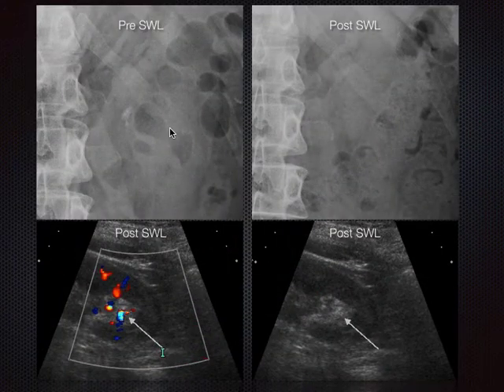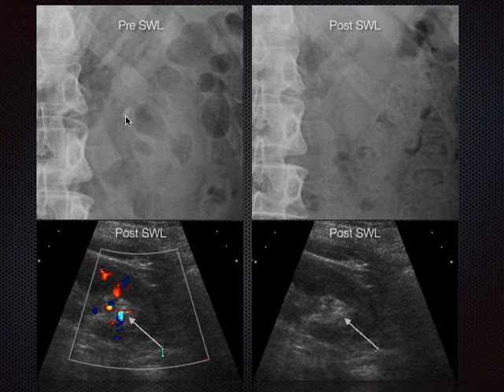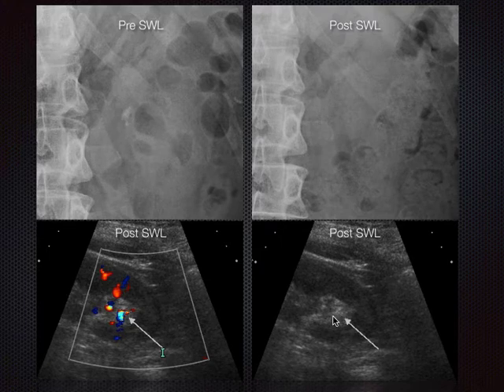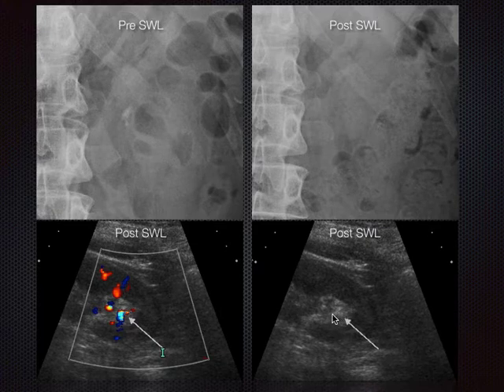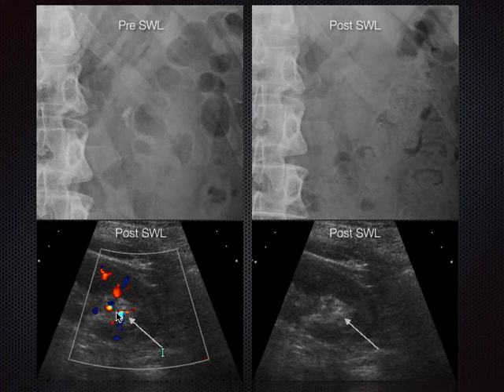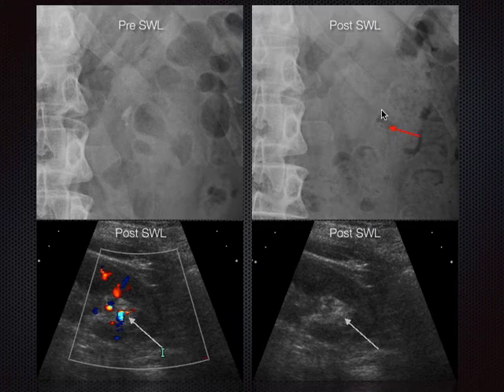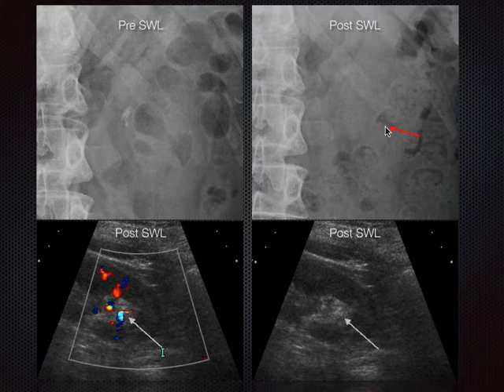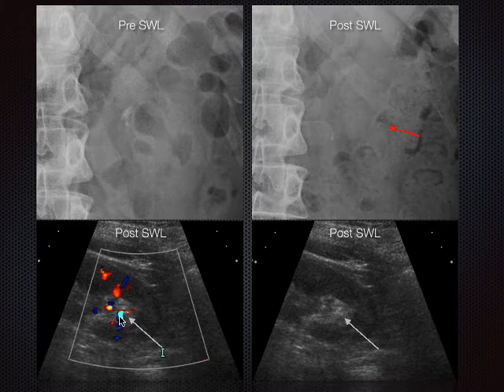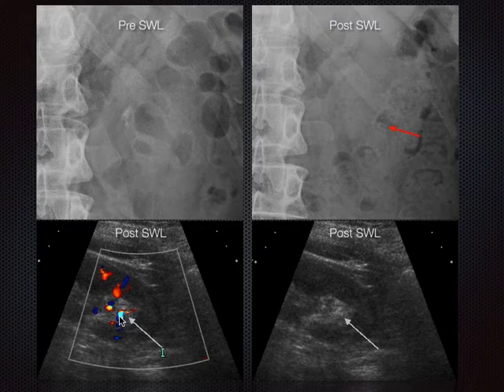This is a recent case: a patient had a one-centimeter stone in the renal pelvis and had lithotripsy done. On the two-week follow-up ultrasound, nothing was detected in the lower pole—but when we put on the color Doppler, there's a focal twinkling sign suggesting a small cluster of debris. On the radiograph, you can actually see stone fragments in the lower pole. This would be easy to misinterpret as stool in the absence of the ultrasound twinkle, so the twinkle actually improves our ability to carefully search for residual stones on the radiograph.